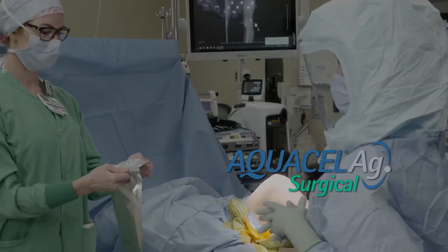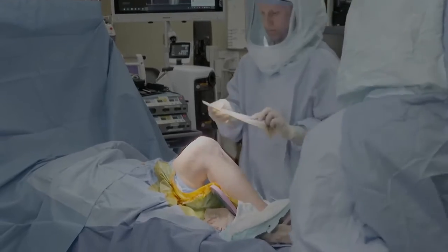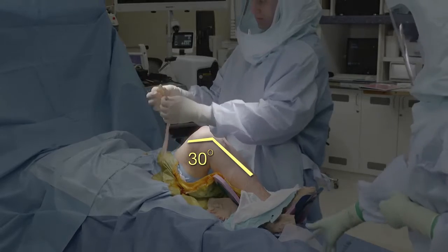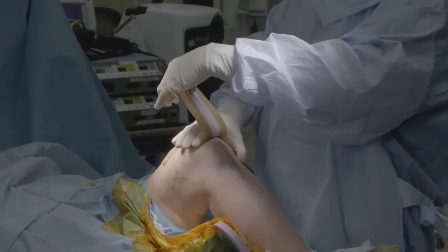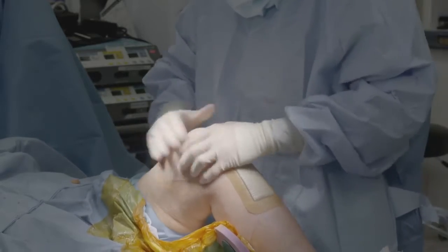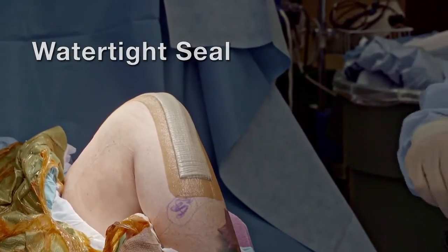The dressing is then opened sterilely and applied sterilely in the operating room. It is important that the dressing is applied with the knee in slight flexion, and we recommend approximately 30 degrees. It is important not to stretch the dressing upon application. The dressing should be gently molded to the skin, and be careful to smooth any creases, as this helps to ensure a watertight seal. The dressing is waterproof, and the patient may shower immediately.